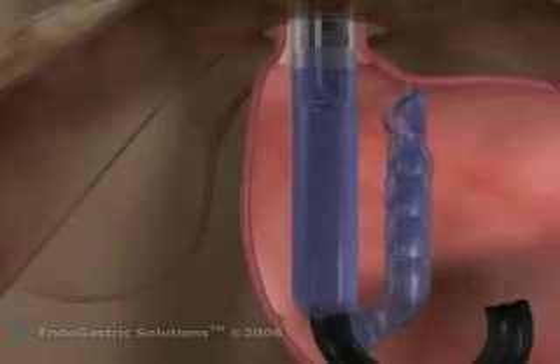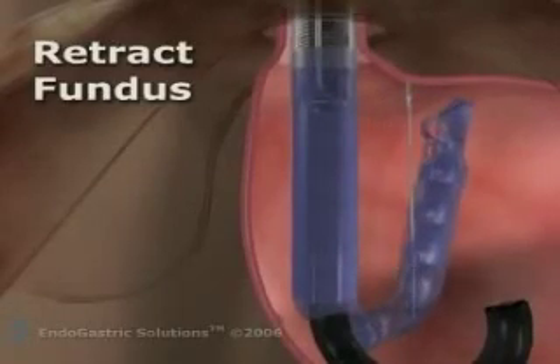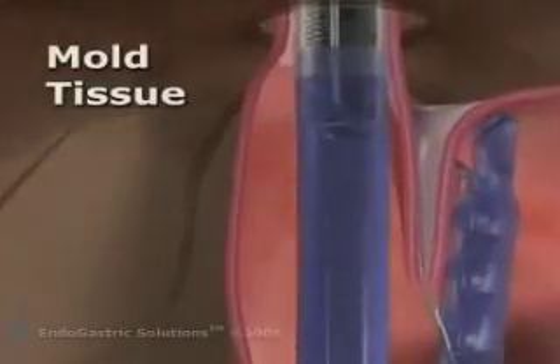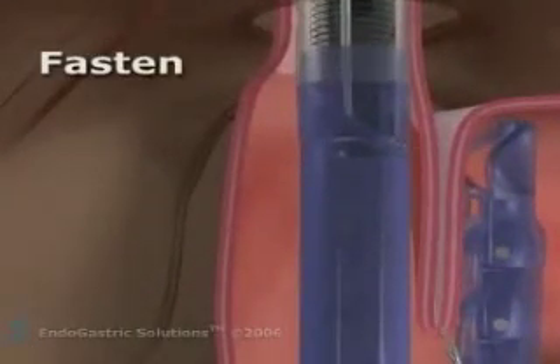In the following step, a retractor pulls down a 3-5 cm flap of fundus and positions this tissue in the center of the device to begin the reconstruction of the valve.